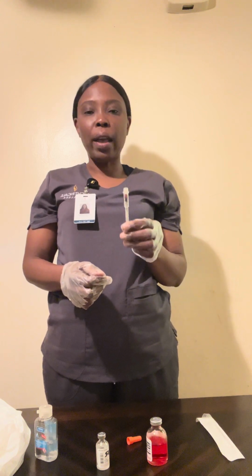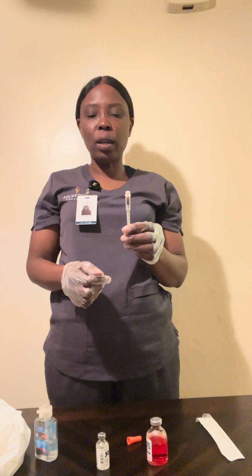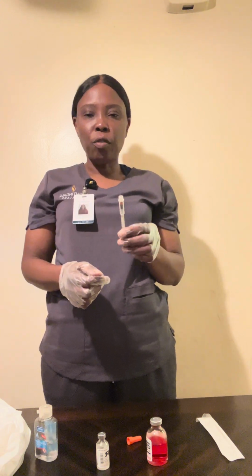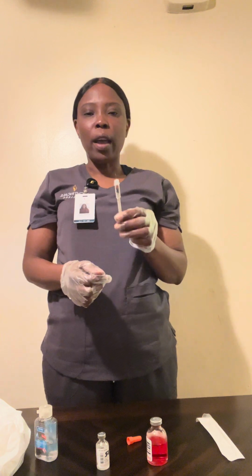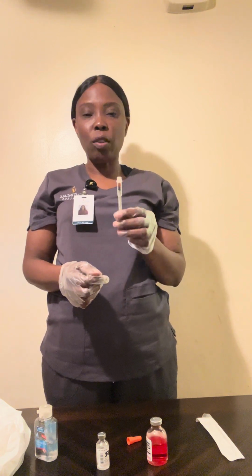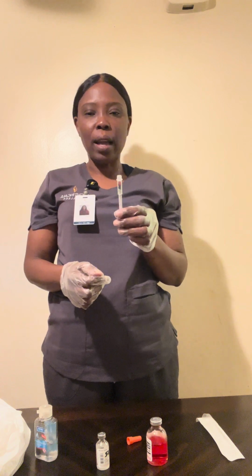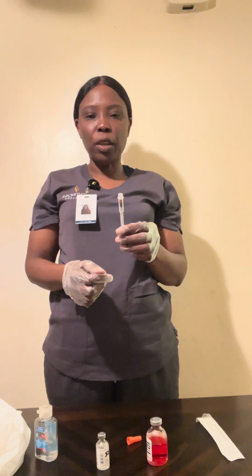Then I'm going to withdraw away from the patient, carefully recap the syringe, and label the dose and the medication. After that I will administer to the patient.